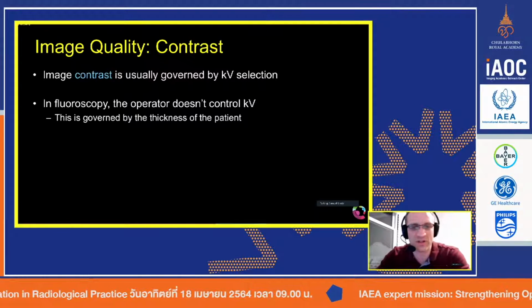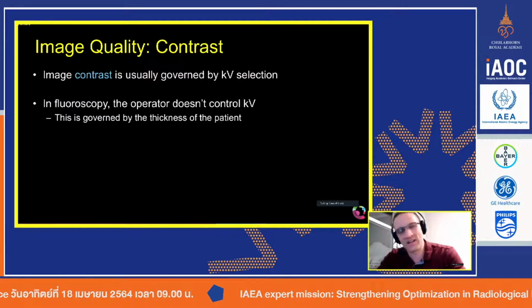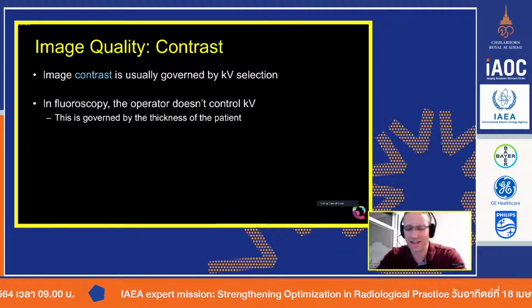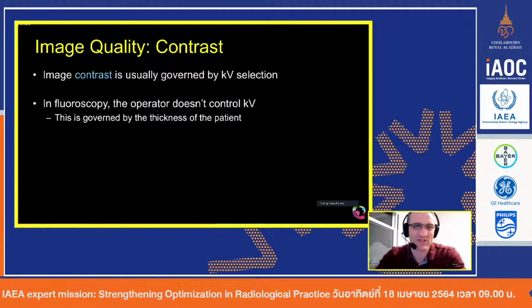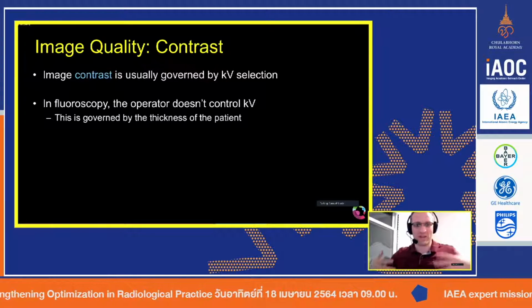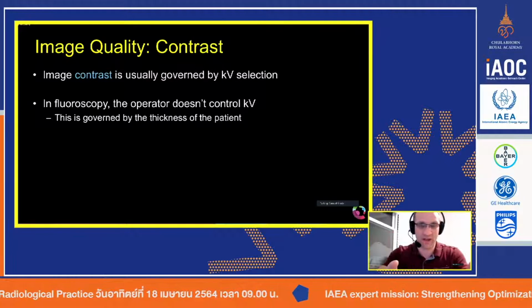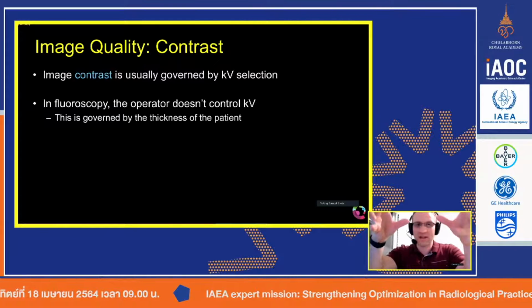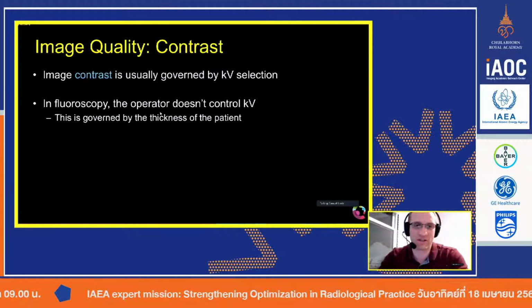Now that's important for the radiologist. It's the same for any of you that have been indoors all day and then walk out into that beautiful Thai afternoon and it's really sunny. The first thing you're going to do, at least for me because I have blue eyes, is that I can't see for the first couple of seconds until my pupils constrict. It's the same concept. If we were panning from a really big abdomen where the system's pushing a lot of photons, and then it shifts into the chest where there isn't, the screen itself would be extremely bright, like staring into a light bulb.